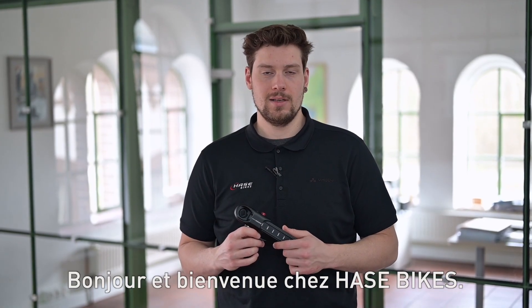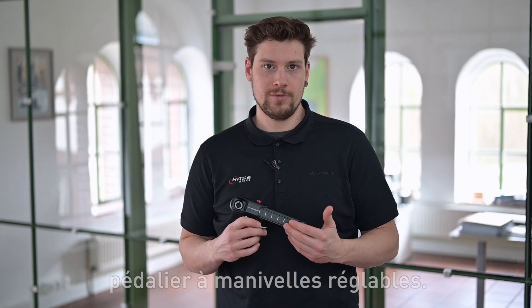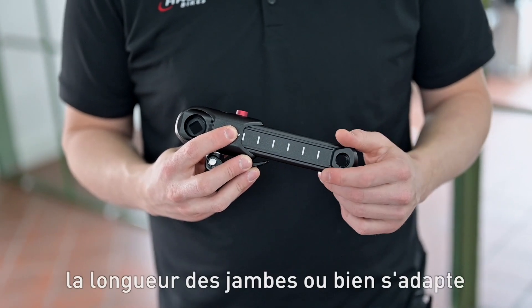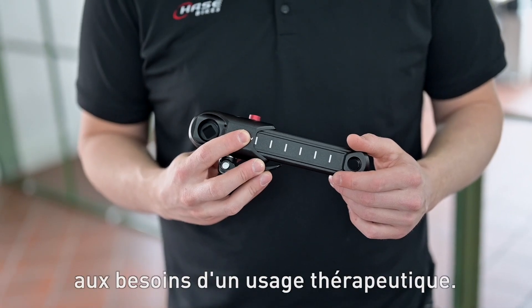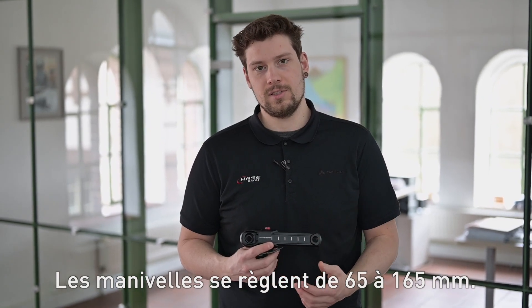Hello and welcome to Hasebikes. My name is Dario and in this video I'd like to tell you about our length adjustable cranks. These cranks are very easy to adjust as needed for various leg lengths or therapeutic purposes. No tools are required. The adjustment range is 65 to 165 millimeters.